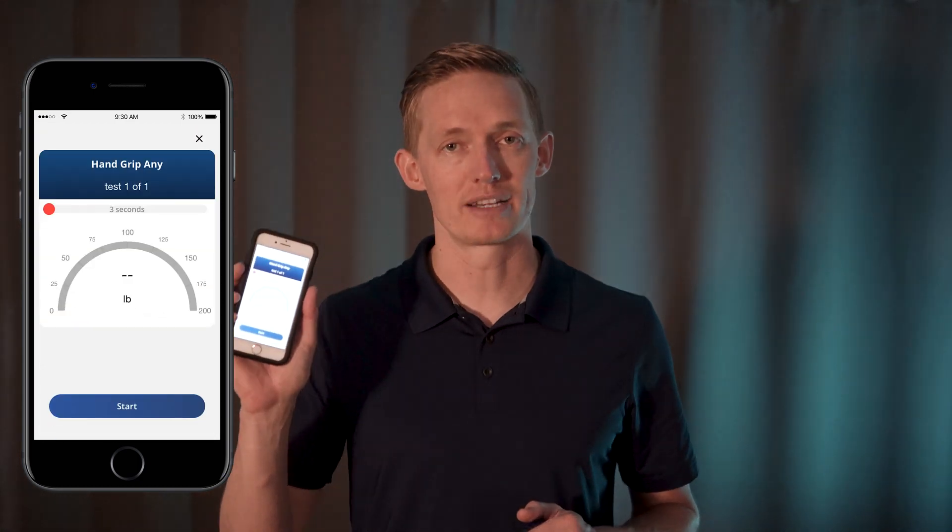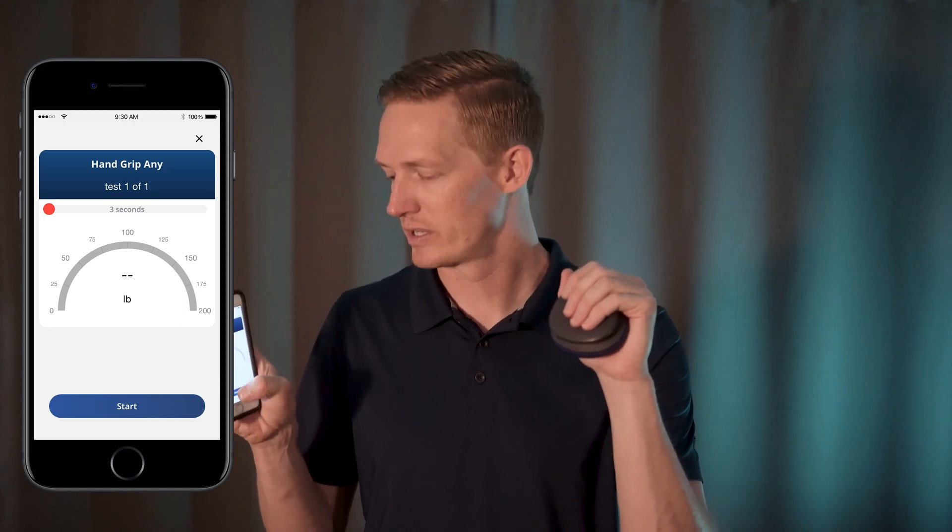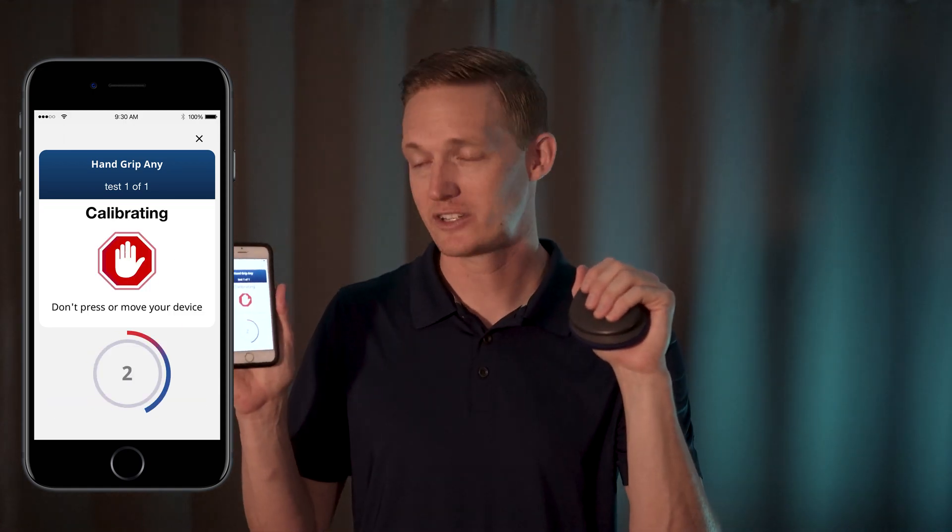Once your test is named, you'll be brought to the calibration screen where you can get to starting position and make sure you don't apply any additional force during the calibration sequence. Once it's done calibrating, you'll see go. You can apply force for the duration that you preset in your settings.